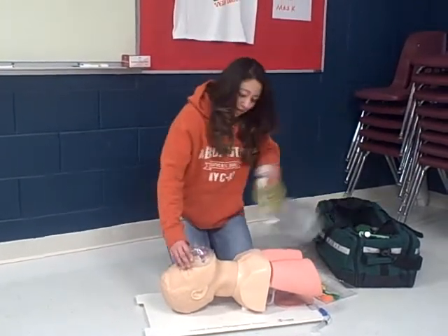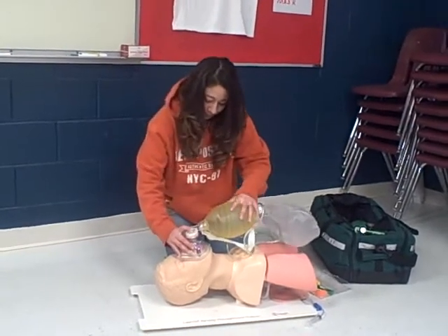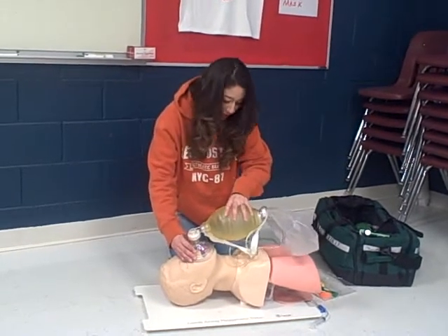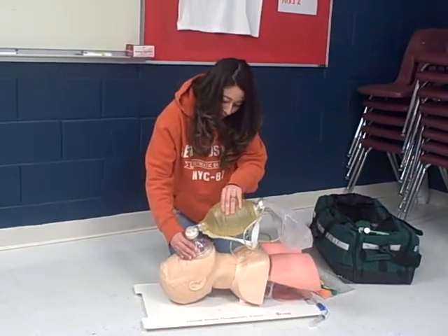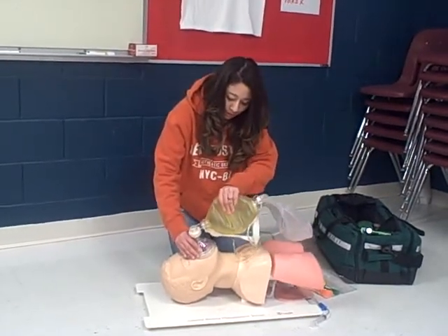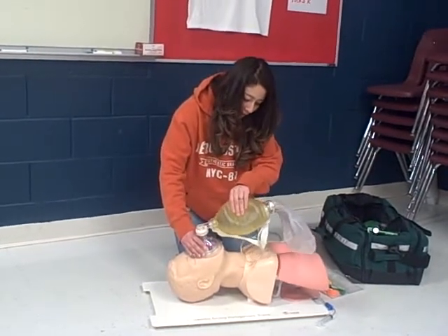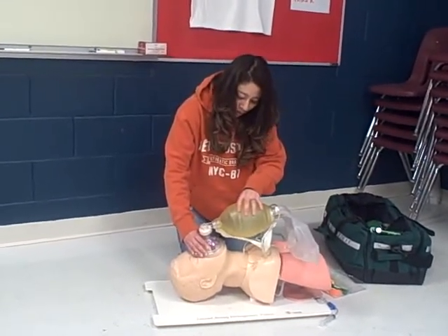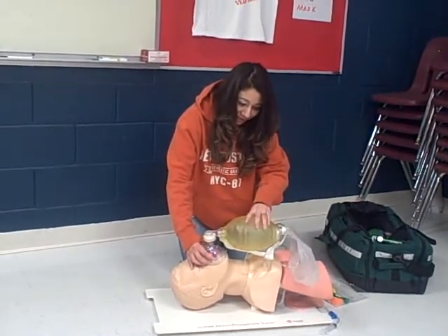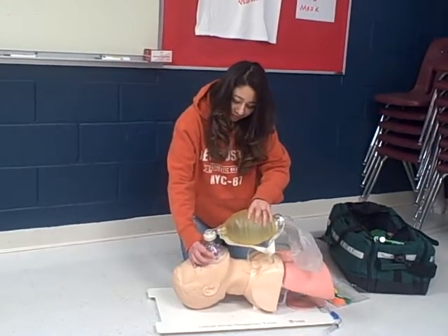Then I will attach the bag. One one thousand, two one thousand, three one thousand, four one thousand. [Repeats ventilation count for 30 seconds.] I have witnessed at least 30 seconds.